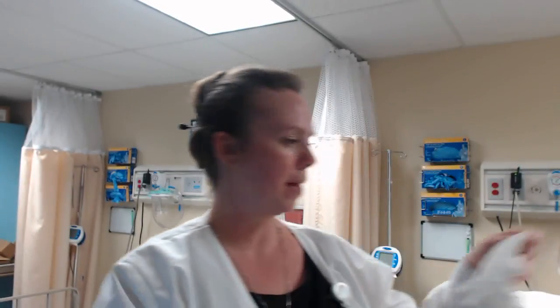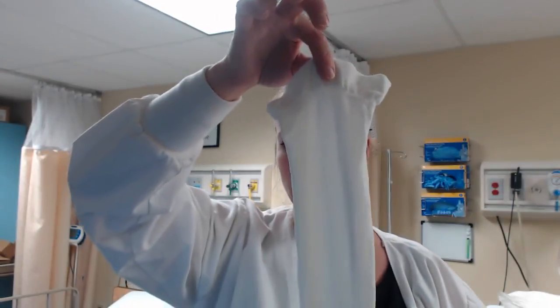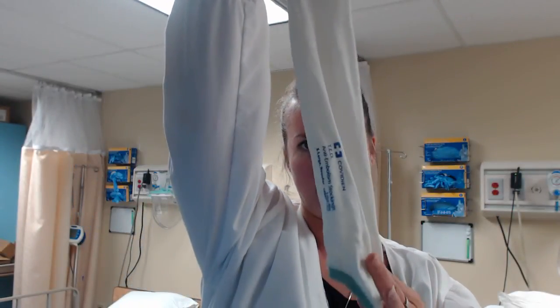These are often put on patients who are going to the operating room or post-op patients, maybe who've had some ortho surgeries. So you might see the order for thigh-high stocking as opposed to what's called the knee-high stocking, which is certainly much shorter, and it's only meant to go up to the knee, not over the knee.